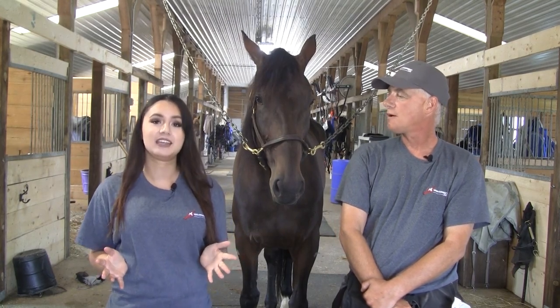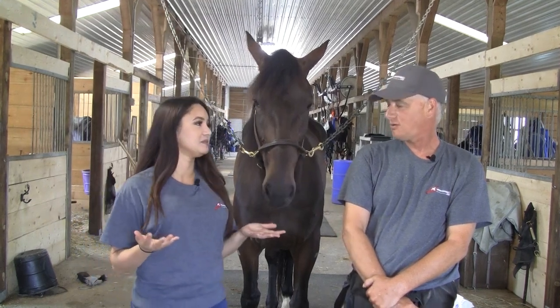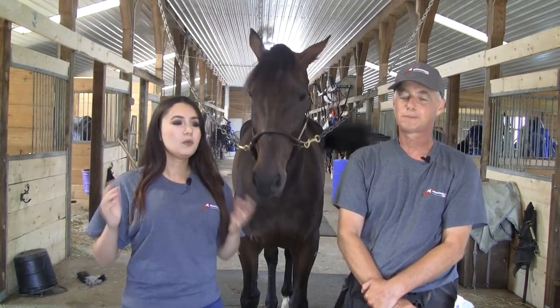Joining me today is one of Standardbred Canada's ID technicians, Mike Pennington. Thank you so much for joining us today. Pleasure to be here, Rachel. So Mike, walk us through the process.